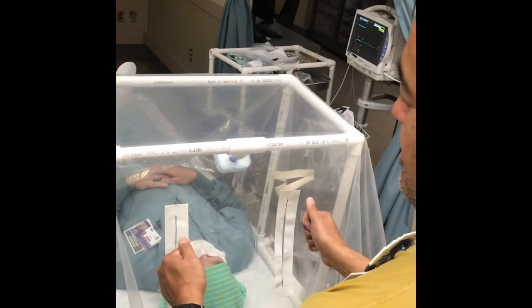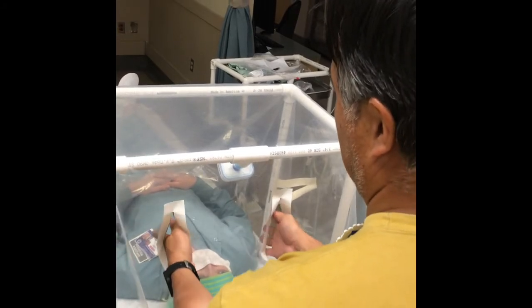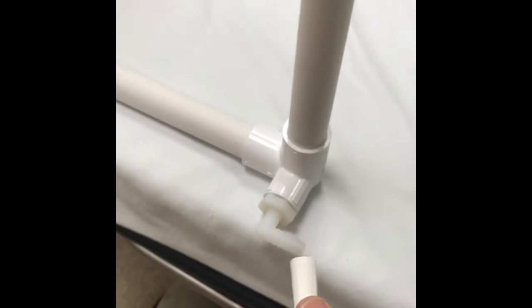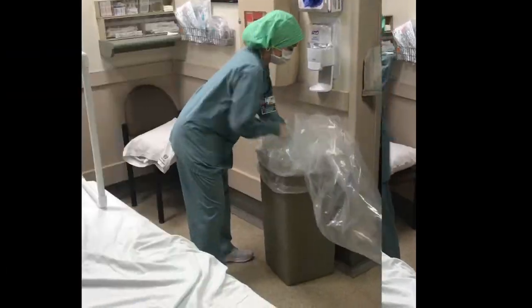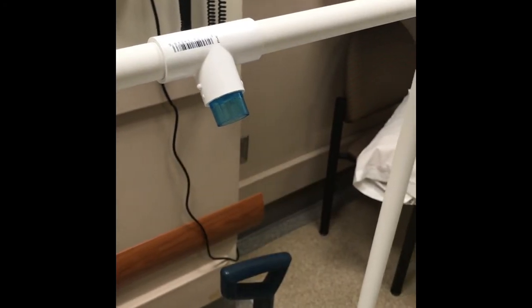If possible, keep the NPE on as long as possible to allow more time for the negative pressure to remove the viral particles. Once the procedures are completed, the side exhaust port hose can be removed. The drape can then be removed as well and thrown away, followed by removal and disposal of the viral filter.